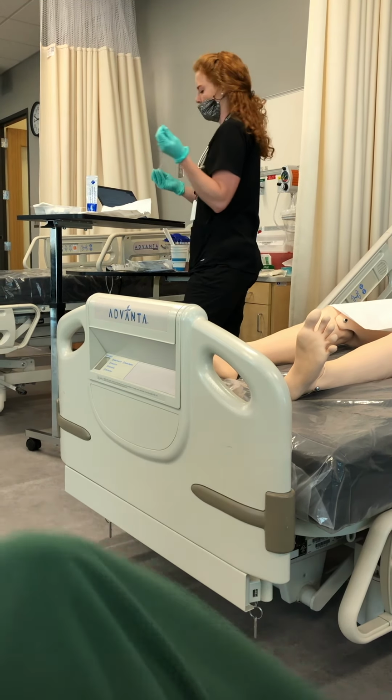So we'll have different options for you. The idea is you just want to make sure that you have something that will occlude that suction port. So over here, it's this little horn-looking guy, and then on this green one, which is probably what you're going to end up with, this little lift here, you can use that for your thumb as you're utilizing the suction.